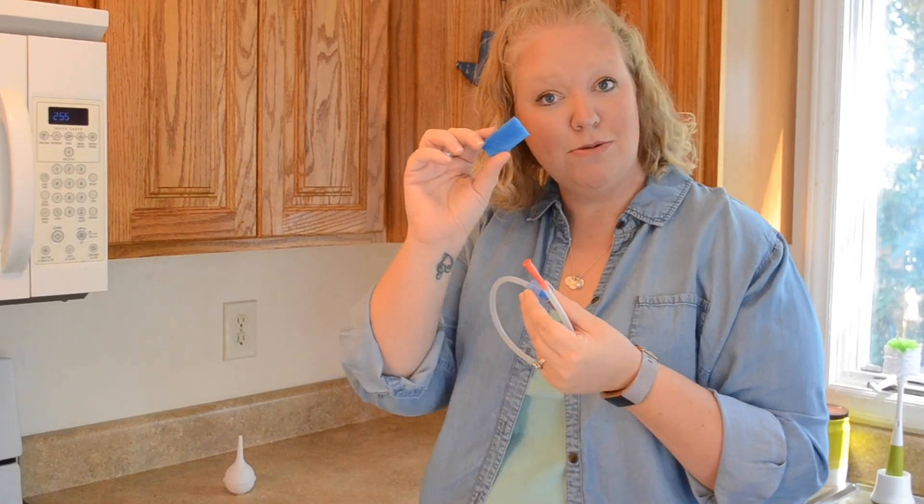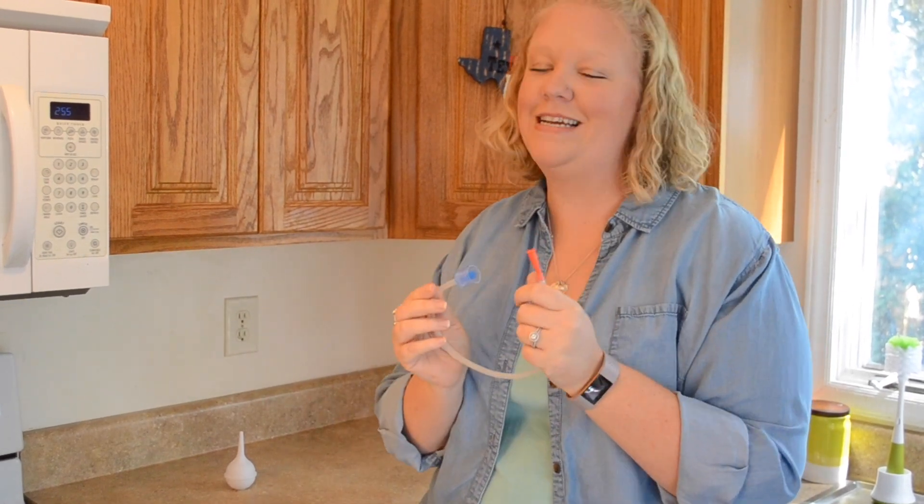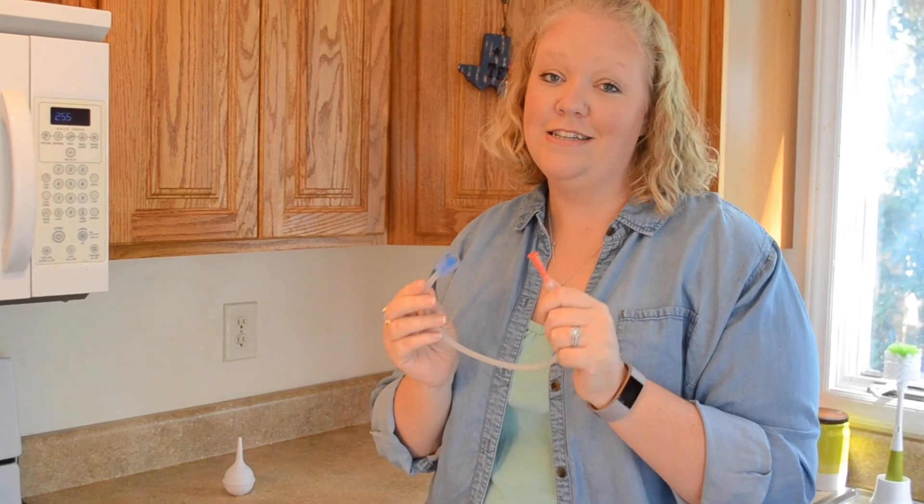It comes with replacements and you can also buy replacements separately. It's really amazing — when your baby is sick and you have no other options, this is the way to go.